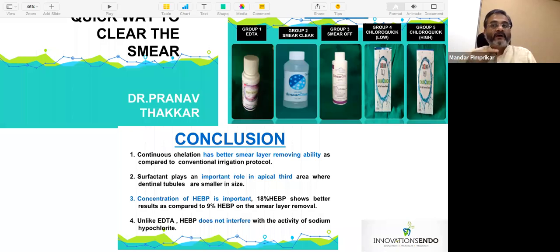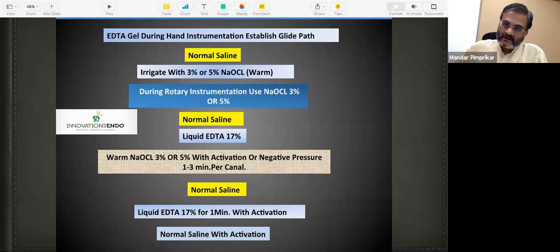So it is up to you what to do, whether you want to continue with the continuous chelation or be with the traditional irrigation protocol. So that brings me to a slide where I'm going to explain what should be the irrigation sequence during and after instrumentation, after a lot of things have been discussed about the activation, the irrigants, the advantages, the disadvantages. So the EDTA gel to be used during hand instrumentation to establish the glide path. Then you use normal saline. Then irrigate with 3% or 5%, preferably warm hypochlorite.